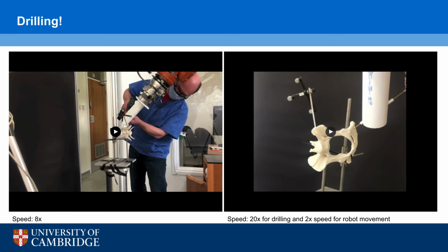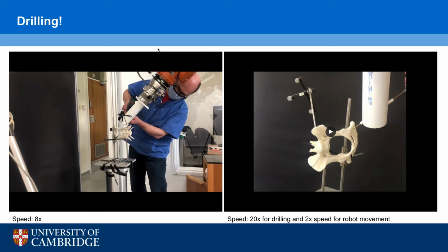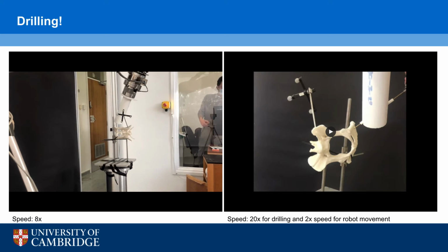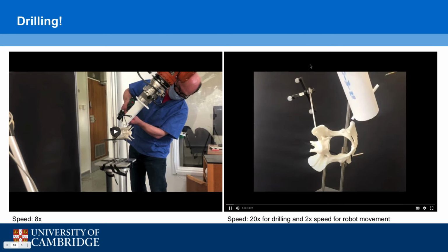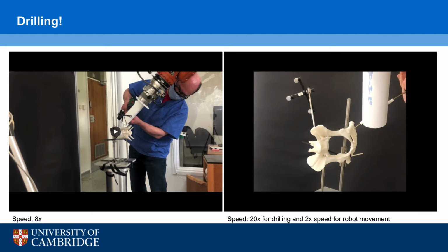Professor Allen selected 5 different targets, and we drilled them, and then we check for their accuracy later. Again, as that's quite far away, there's another video here of us drilling much closer to the bone. Okay, so I slowed down the robot speed as well, so we can clearly see how it's moving from target to target.